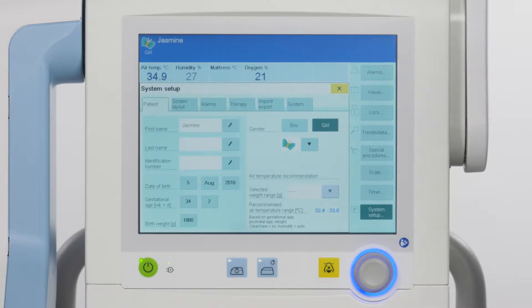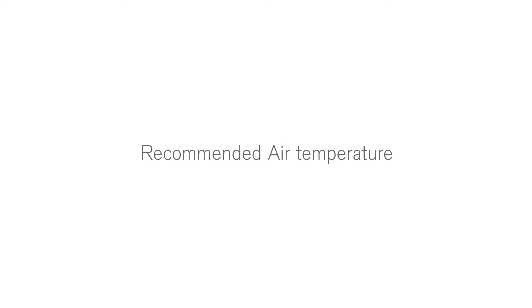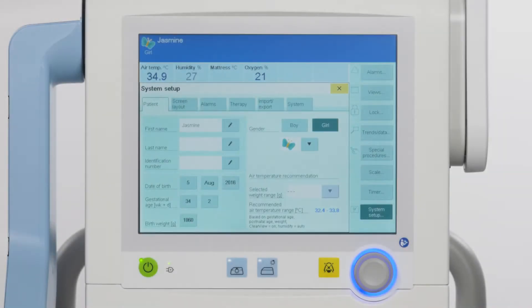Keep in mind that you can only delete data by restarting the device. The device uses patient data, such as date of birth, gestational age and weight, to determine an air temperature range for the patient.